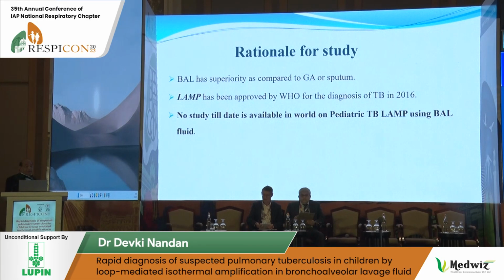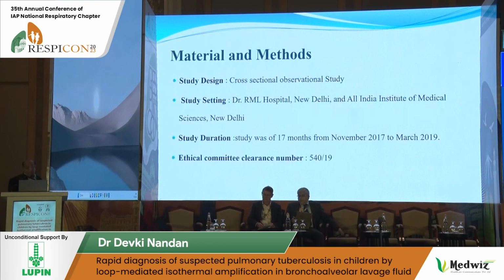The rationale for the study: BAL has superiority as compared to gastric aspirate or sputum. LAMP has been approved by the WHO for the diagnosis of TB in 2016. No study till date is available in the globe on pediatric TB LAMP using BAL fluid.